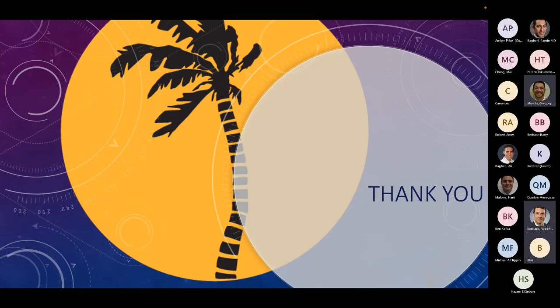Awesome. Thanks, Amber. One of the things that no one puts in these articles, by the way, Amber, and is a definite confounder, is technical error. For instance, if you think about a 3-column osteotomy, nothing should be safer than a 3-column osteotomy, in my opinion, because you have absolute control over everything. You're able to shorten, lengthen, untwist, and manipulate your mechanical environment theoretically to its greatest degree, unless somehow you disrupted the vascular supply. Apart from something like a spinal cord stroke, that's the best scenario, right?